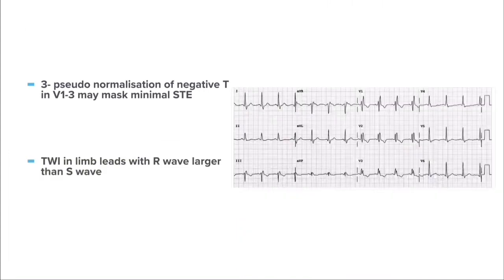Another finding is T wave inversion in limb leads where R wave is larger than S wave. In the ECG, in lead 3 there is T inversion, but the terminal QRS deflection is upright and the S wave is more than R wave — in that case, T inversion can be normal. However, in the absence of this feature, if there is T wave inversion in two anatomically contiguous limb leads, it again indicates ischemia.